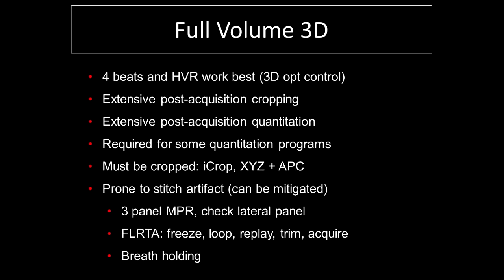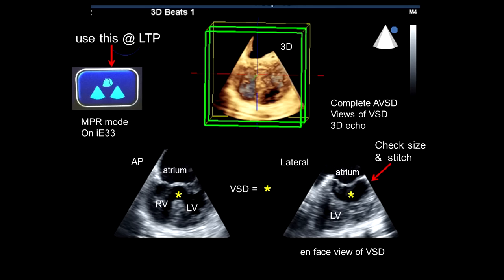Keep this acronym in mind: FLIRTA — Freeze, Loop, Replay, Trim, Acquire. When doing 3D full volume acquisitions, don't hit the Acquire button first. Hit Freeze, then go through Loop, Replay, and Trim, so that you acquire only single RR intervals at a time — only the best ones, free of stitch artifact and of high resolution. Also, breath holding is important — if you can have the patient hold their breath or have anesthesia hold breath in the OR or cath lab, this eliminates stitch artifact caused by respiratory movement.